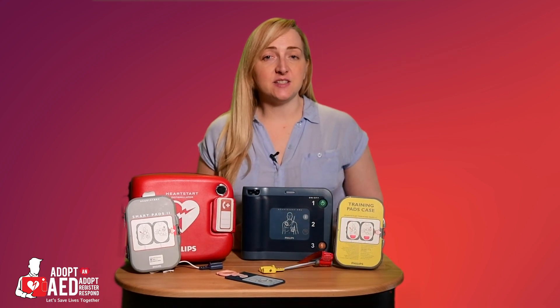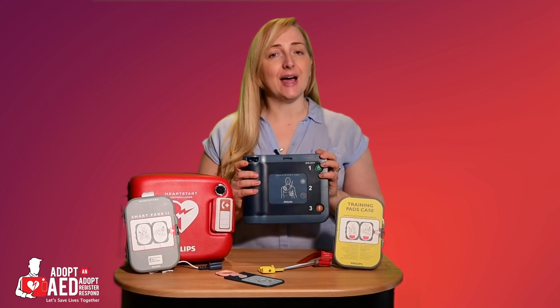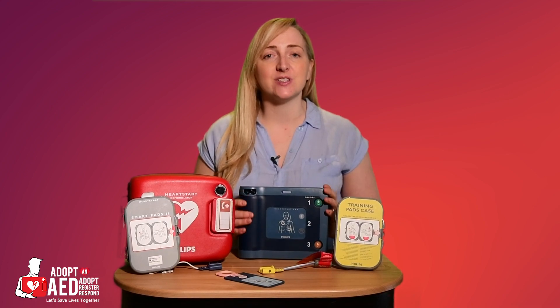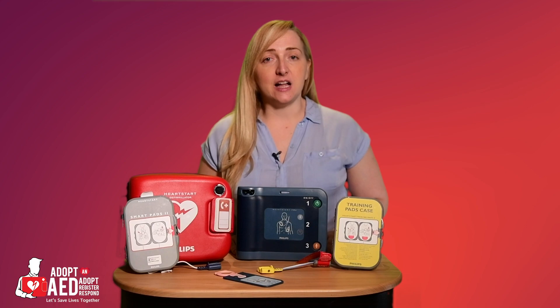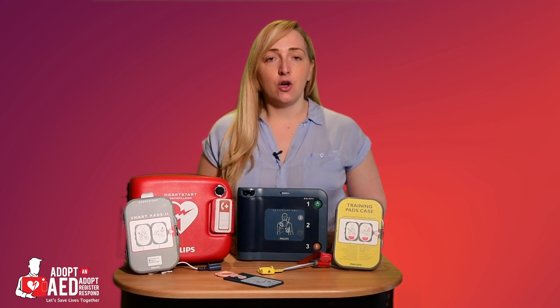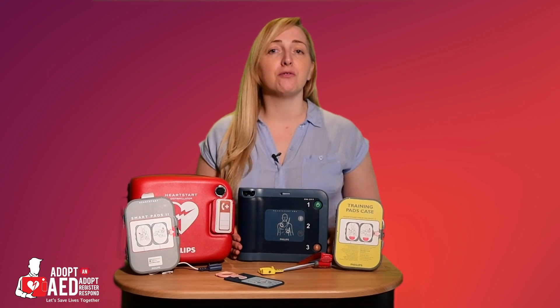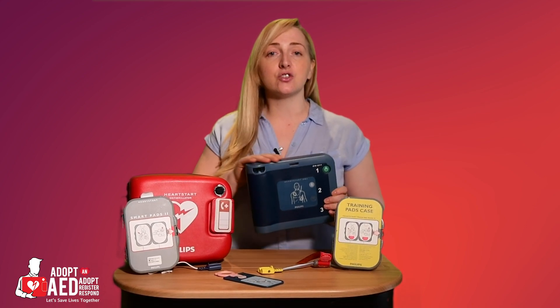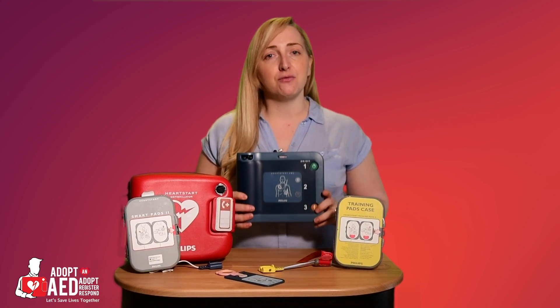This type of AED is designed for an outdoor environment. The FRX is rugged, lightweight and reliable and can withstand extreme temperatures, dust or wet environments. It can be used at an altitude of 15,000 feet or 4,572 meters and can withstand a drop of 4 feet to any edge, corner or surface. It also operates between 0 and 50 degrees Celsius.